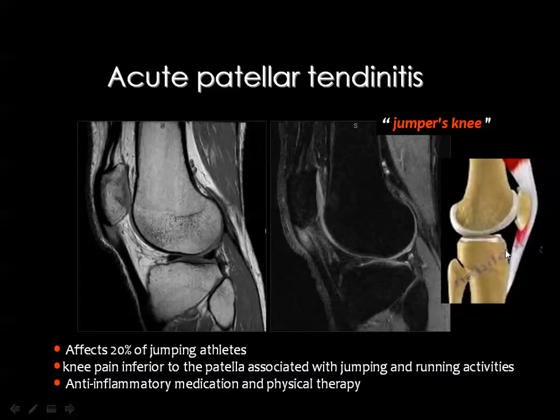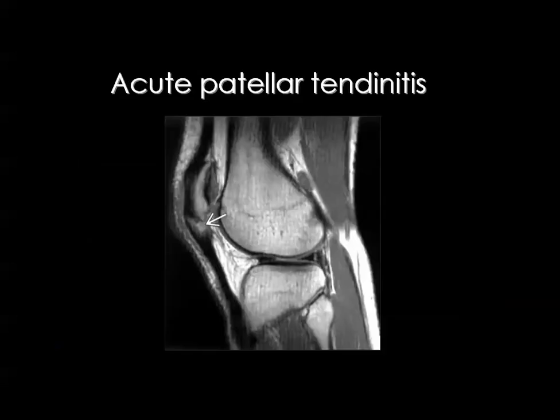And this is a diagram showing the common site of abnormal signal within the patellar tendon, indicating the patellar tendonitis.